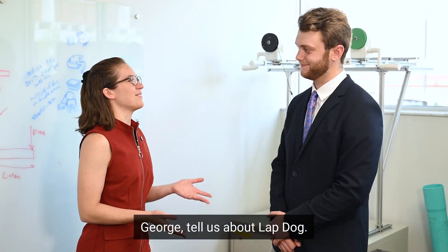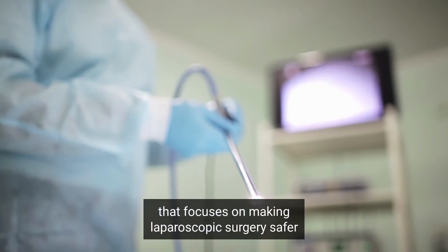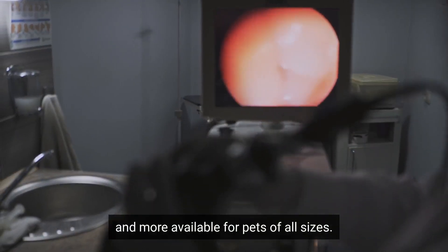George, tell us about LAPDOG. So LAPDOG is our senior design project that focuses on making laparoscopic surgery safer and more available for pets of all sizes.